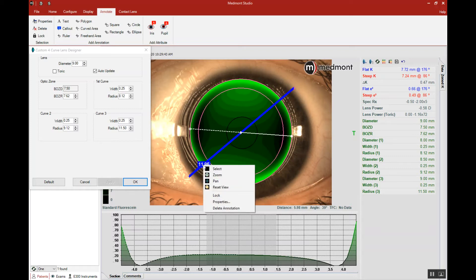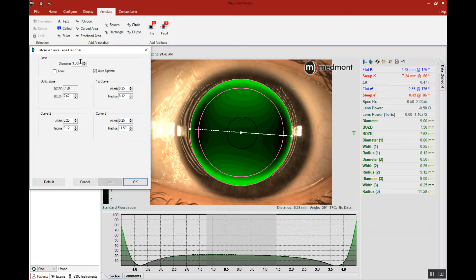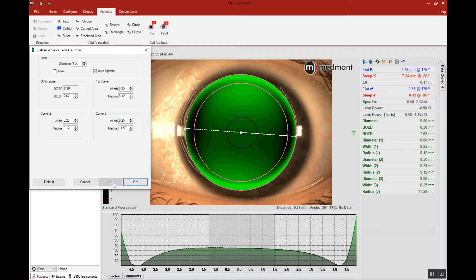We could right-click on top of that ruler we've just created and delete it, and then we select the lens diameter. With a normal to slightly large visible iris diameter, we might select for this patient a 9.8 diameter lens and apply.